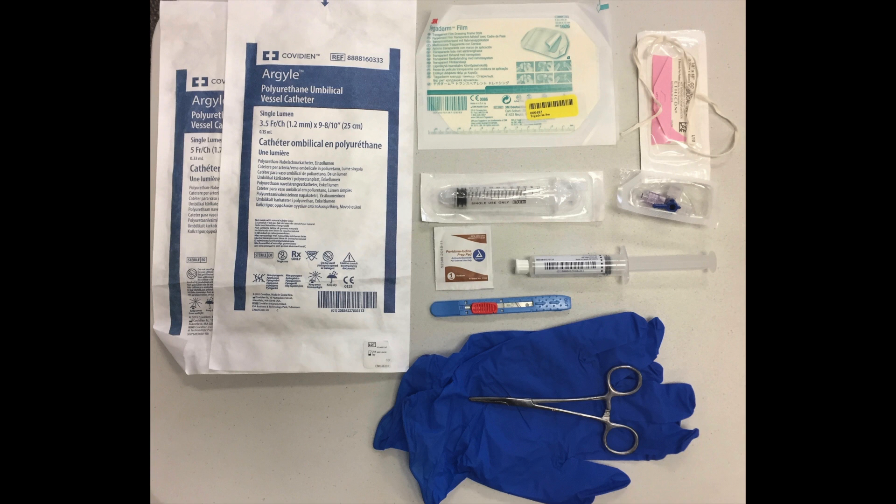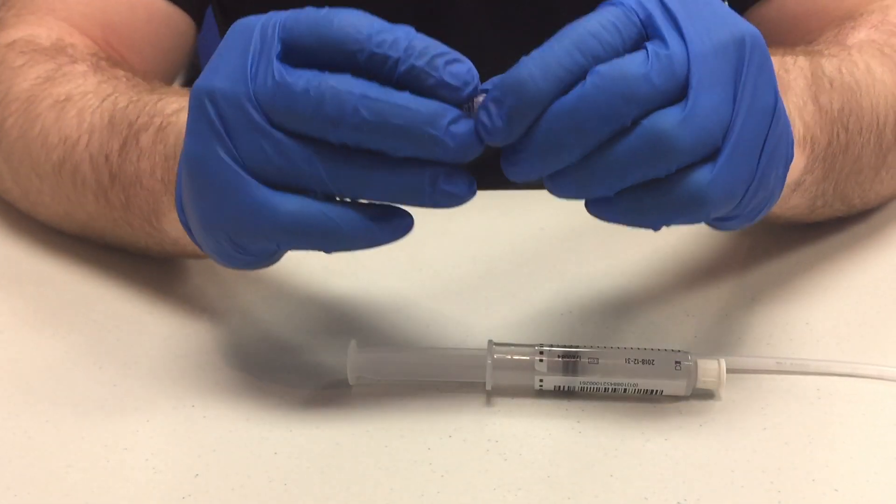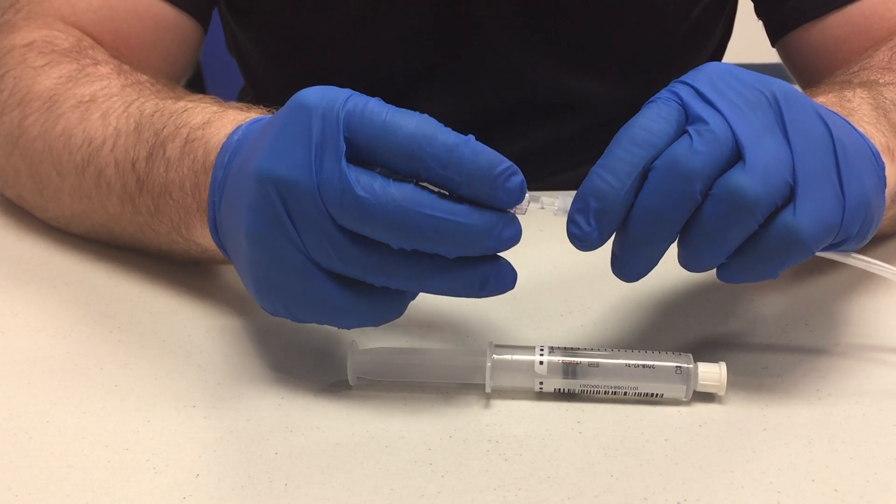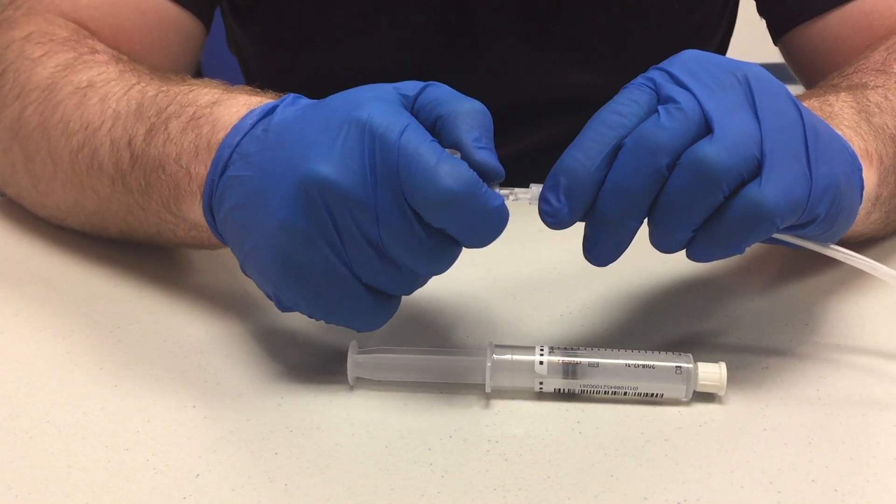In the umbilical venous catheterization kit you will find a 3.5 and 5 French umbilical catheter, a Tegaderm, cotton tape, a 10 cc empty syringe, a three-way stopcock, a 10 milliliter saline flush, an iodine swab, a scalpel, and a pair of hemostats. Before performing the procedure, you must first assemble your equipment.